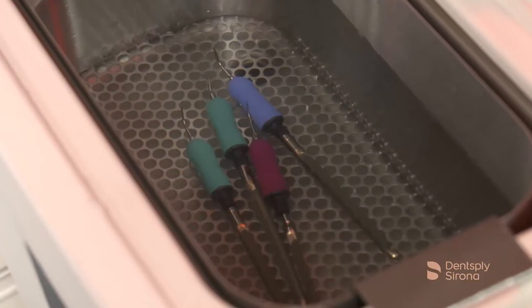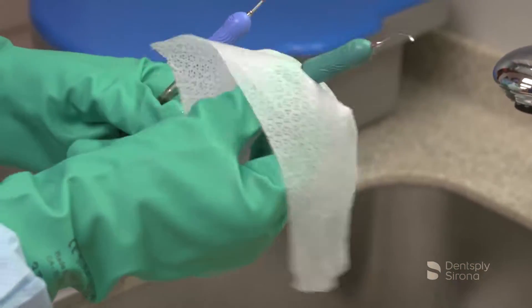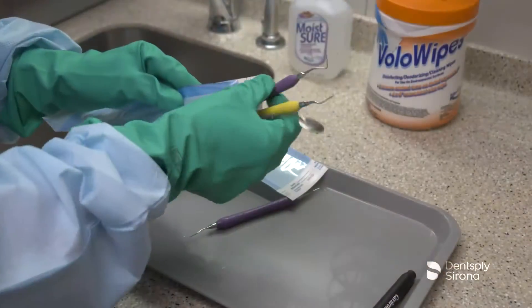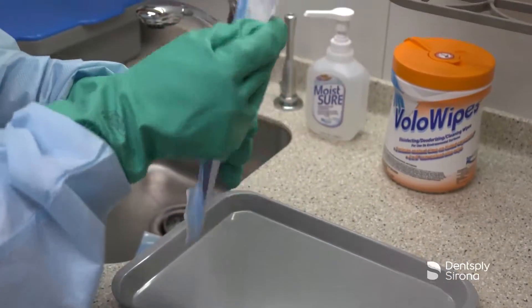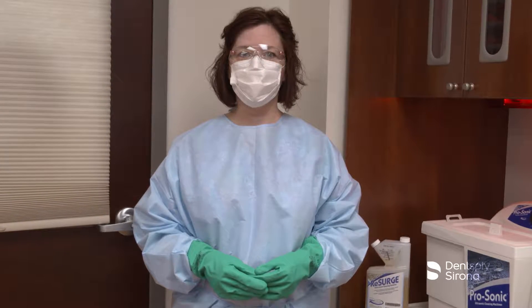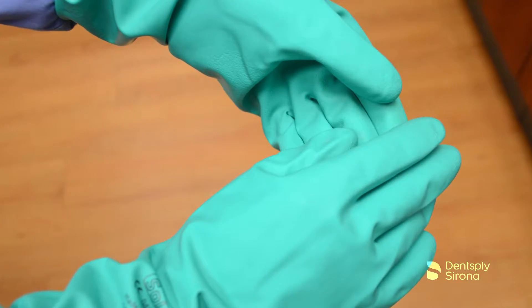Instrument reprocessing plays an integral part in routine infection control procedures. Used instruments can harbor bacteria and bio-burden and should be transported to the reprocessing area immediately after their use. Clinicians should don all personal protective equipment, or PPE, while transporting, disinfecting, and cleaning instruments after their use.